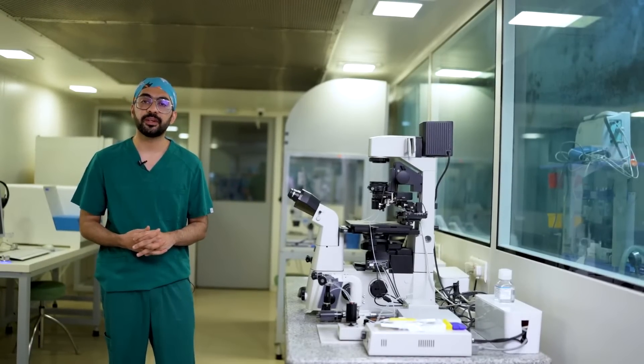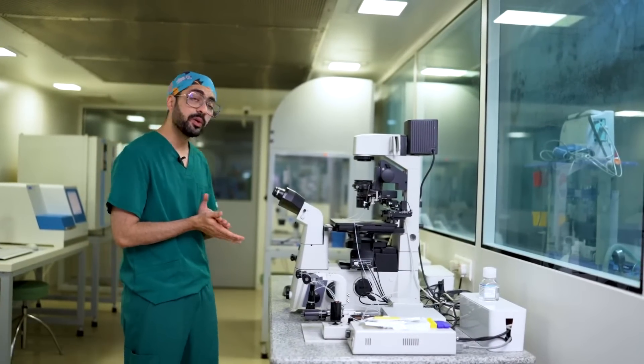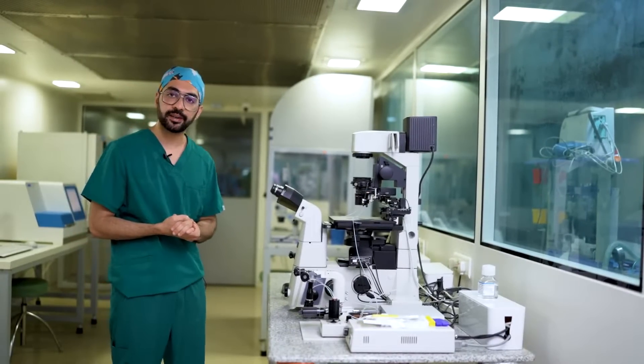Hi, I'm Dr. Keshav Malhotra. I'm the director of META and also the lab director of Rainbow IVF. Today we're going to be talking a little bit about the micromanipulator and how to set it up.